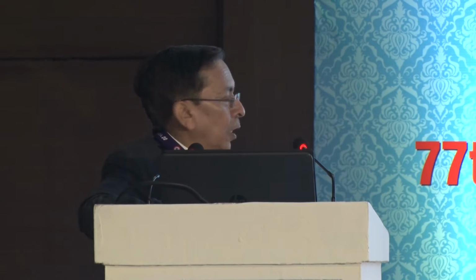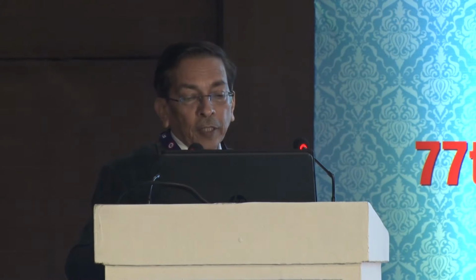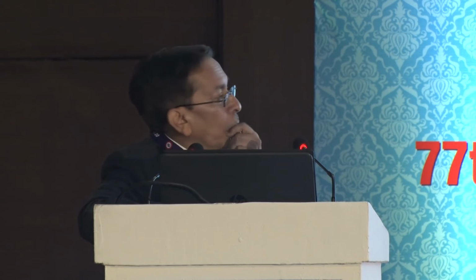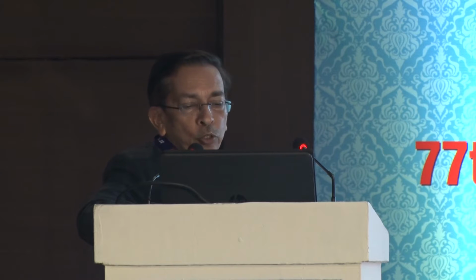So friends, you can go for this; after some 15 days, the Descemet's membrane and cornea are quite clear. So in short, an old Descemet's membrane detachment can be managed if we try for a proper apposition of the membrane.